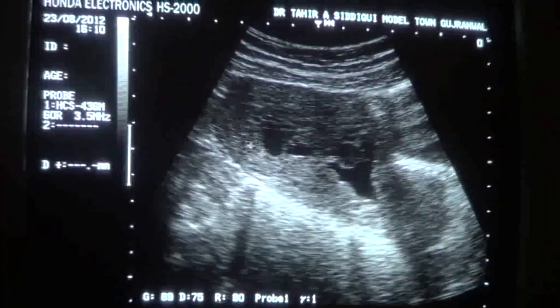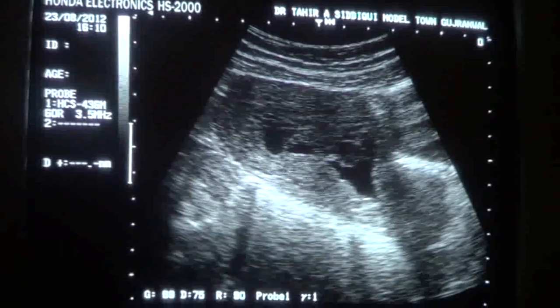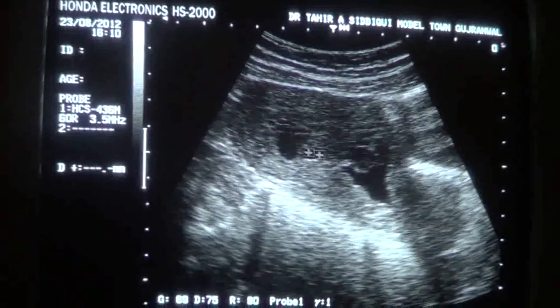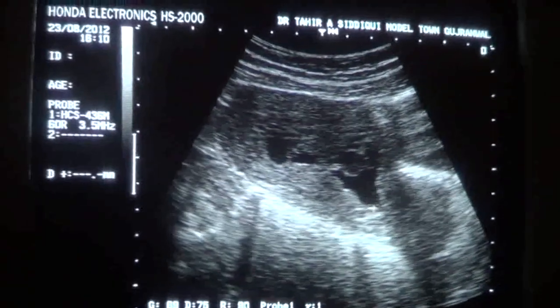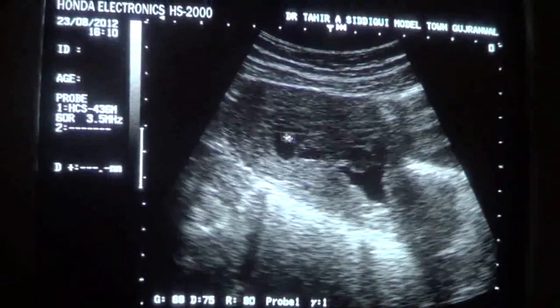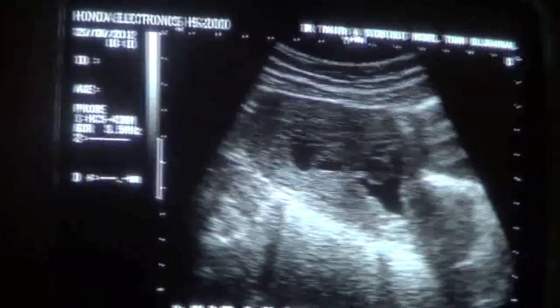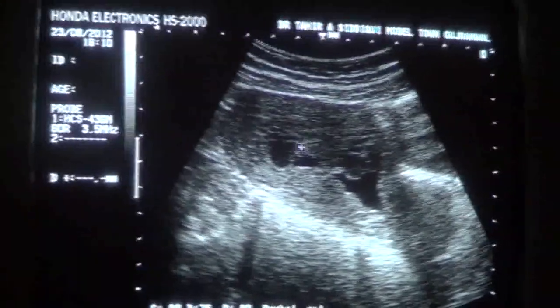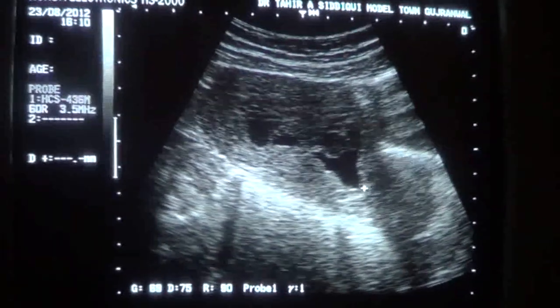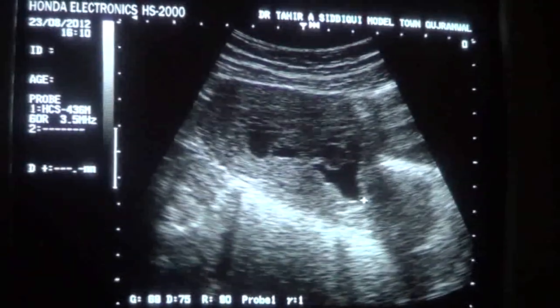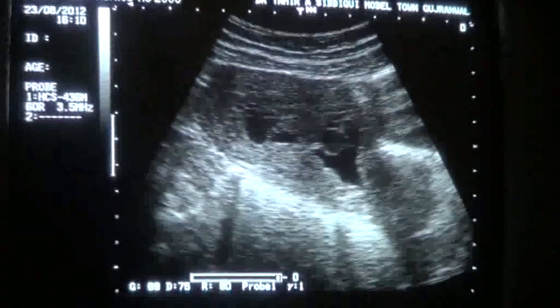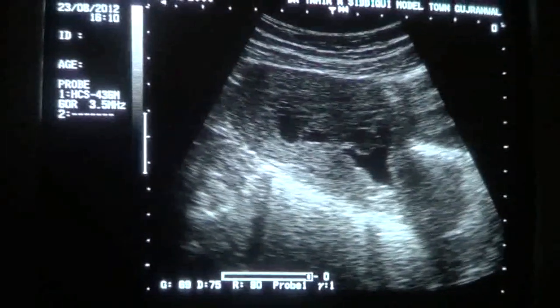This being the uterus, this being the endometrial canal with fluid, and this internal echogenic area being the clot. This is the cervix with closed internal os. So this is the case of the day. Thank you.